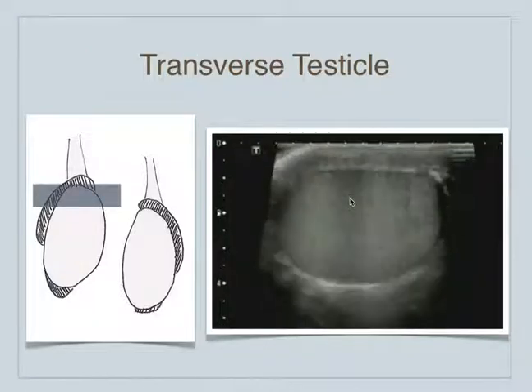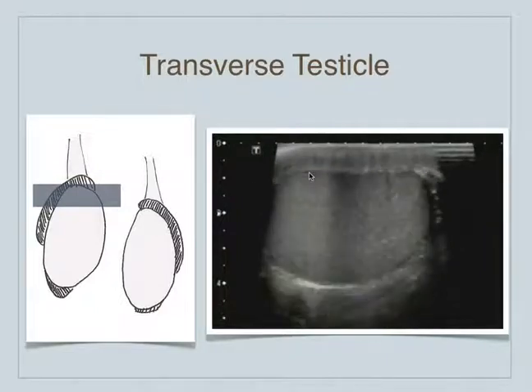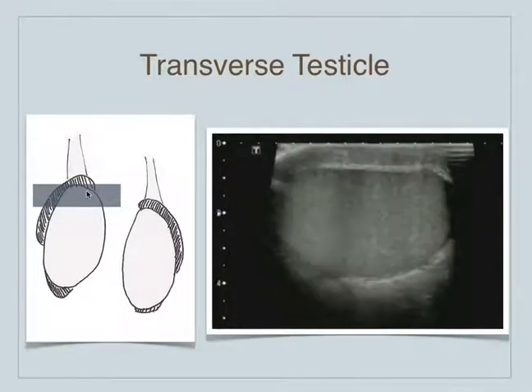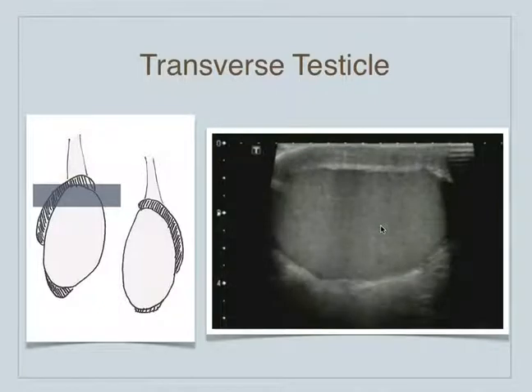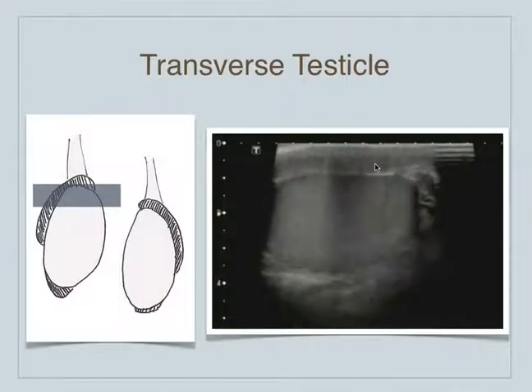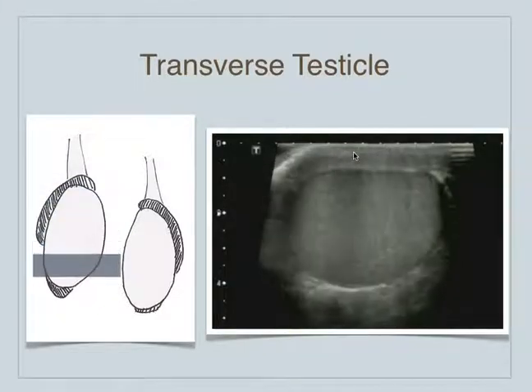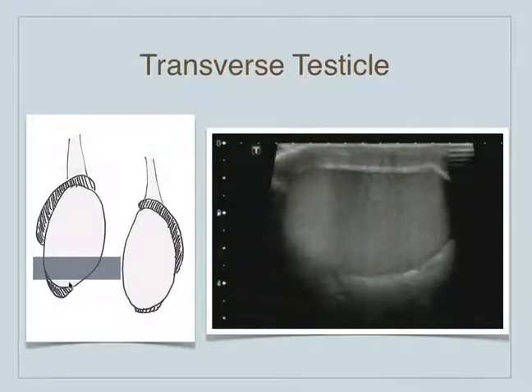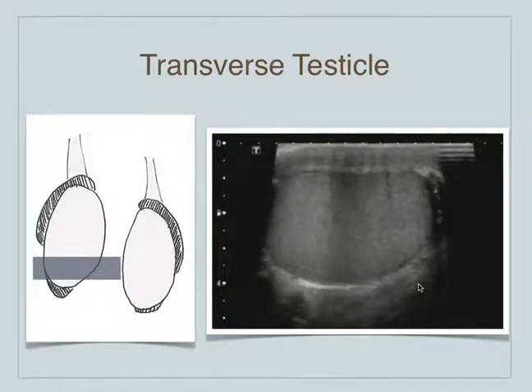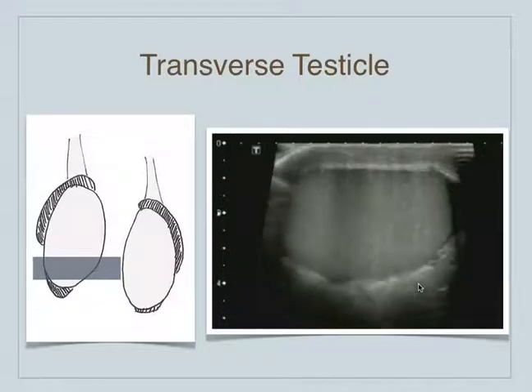The next view is going to be a transverse view. Now we've got a short axis of the testicle. We just basically slide the probe along the testicle, and many times we can see a portion of the epididymis as well. In this portion, all I see is the testicle and the scrotal skin. We just slide that probe down from the superior portion towards the inferior portion, noting the testicle itself for any changes in echogenicity. We want to see a nice isoechoic texture — homogenous — and we don't want to see any areas of focal masses.